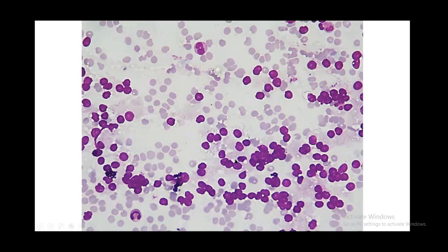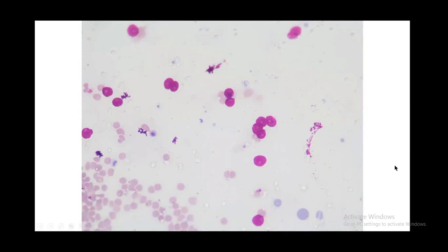Again, here in this slide also, we see that the tumor cells had rounded nuclei, a visible nucleoli, and very fragile, delicate, pale cytoplasm without any cytoplasmic borders visible, and very conspicuous but fine vacuoles in the cytoplasm and also scattered in the background. Many naked nuclei with prominent nucleoli were also seen.